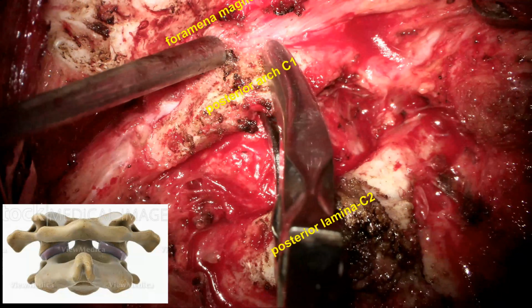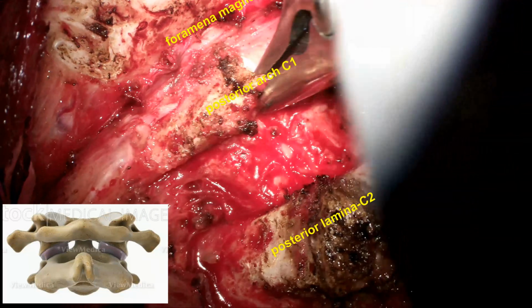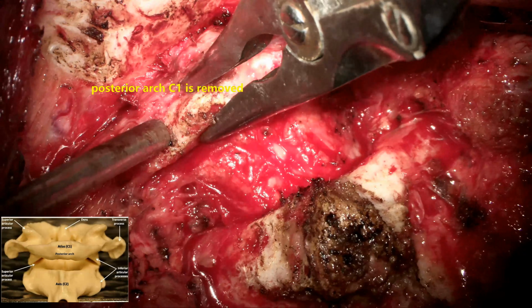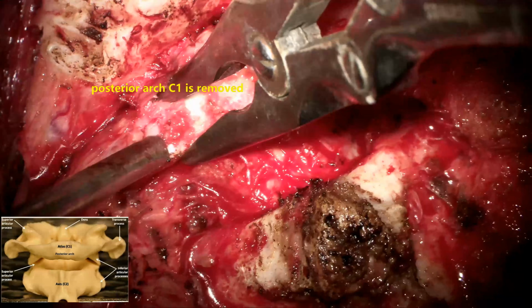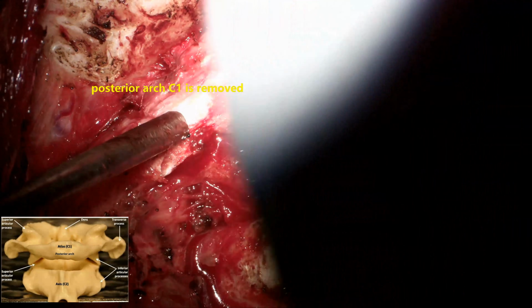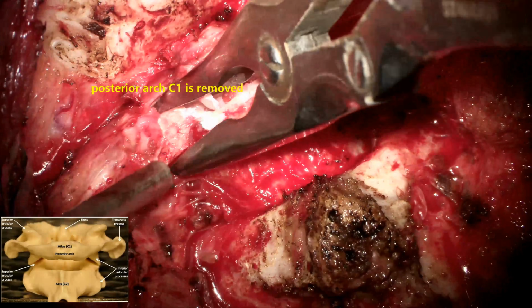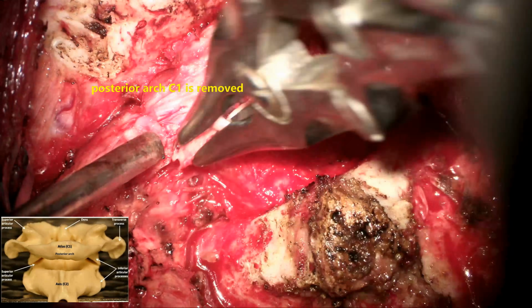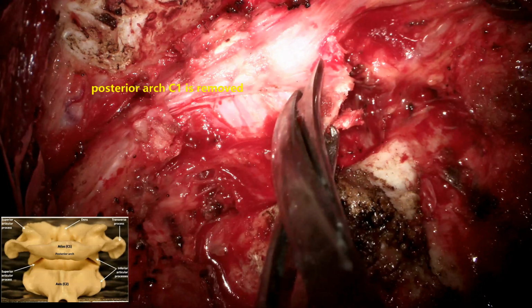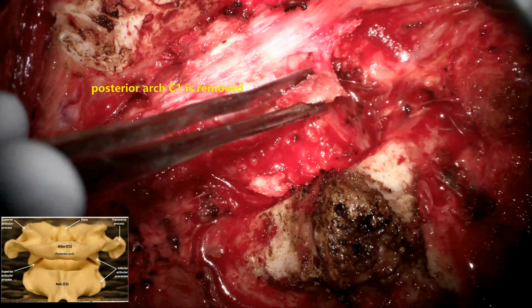Once we expose the subocciput, C1, C2, C3, since there is significant compression posteriorly, we prefer to remove the posterior arch of C1 and preserve the bones because we can use them at a later stage for the graft. The posterior arch of C1 is excised widely from joint to joint. During the procedure, we should not touch the dura because it is already a compromised, significantly compressed cervicomedullary junction. We need to avoid touching the dura mater.